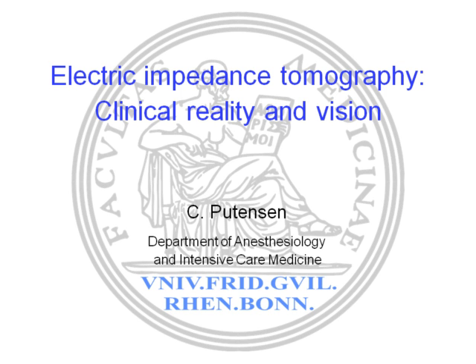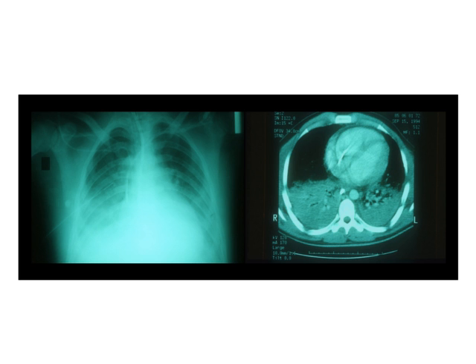Electroimpedance tomography, clinical reality, and vision. Well, when you look in the past, there was the belief that ARDS is a diffuse disease, and in the 80s we learned more about it, that we have densities localized in the dependent lung areas that are not ventilated, not well ventilated, but very well perfused, contributing to interpulmonary shunting and the severe hypoxemia.